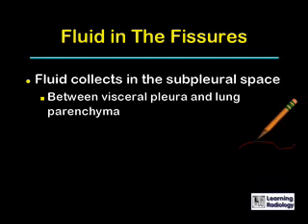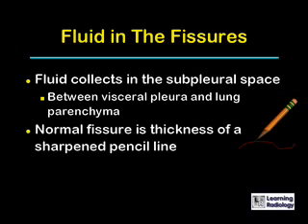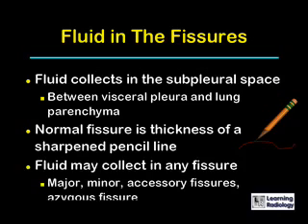Fluid in the fissure collects in the subpleural space usually, which is between the visceral pleura and the lung parenchyma. It could also collect between the layers of visceral pleura. Normally, the fissure will be the thickness of a line that you could draw with a sharpened pencil, and you can see the fissures in a normal individual's chest radiograph. However, when fluid collects in the fissure, it becomes much thicker. You can see this fluid in the major fissure, the minor fissure, accessory fissures, the azygous fissure — any fissure.